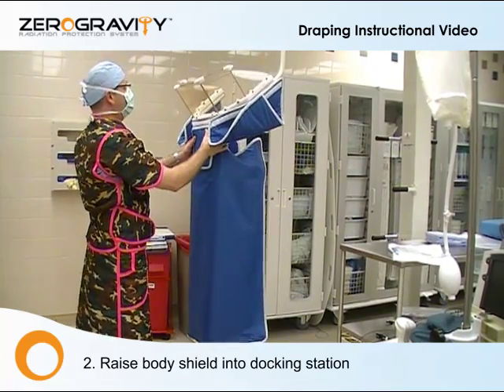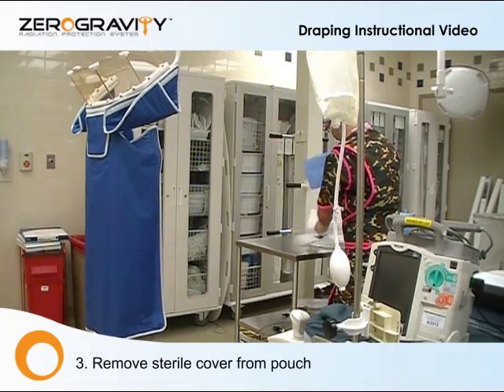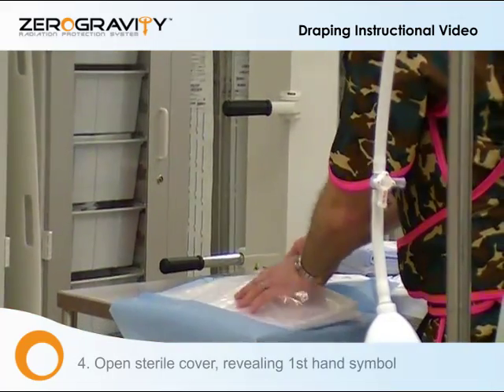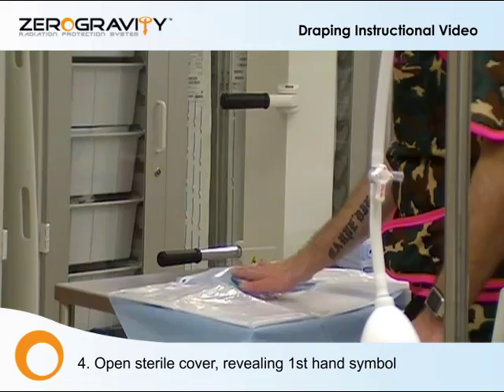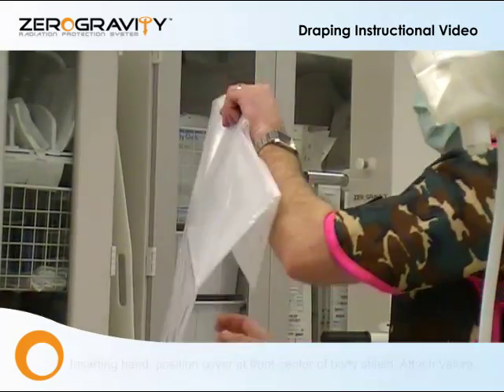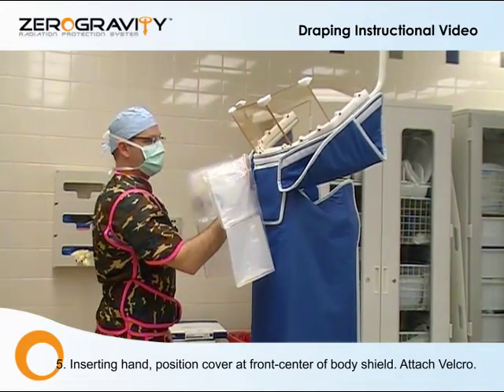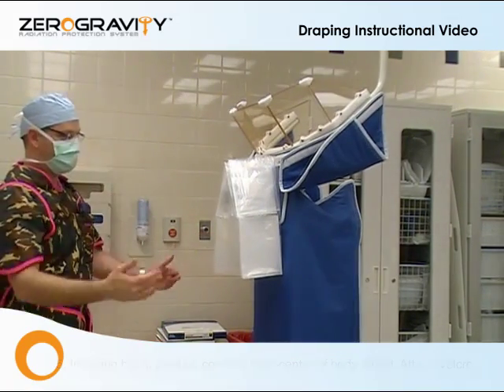Next, we're going to place it at its dock. Open the sterile cover, obviously maintaining sterility. Open the sterile cover until you see the palm label. Insert your hand and place the drape center at the top Velcro location.